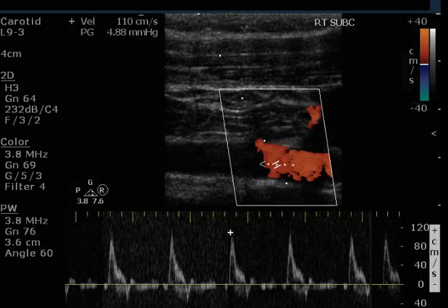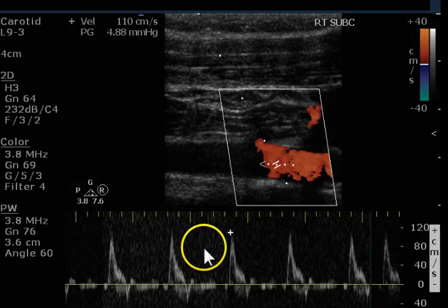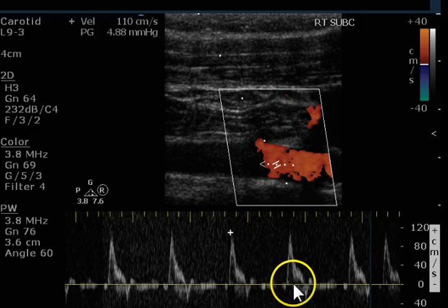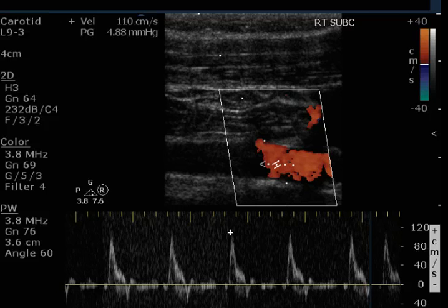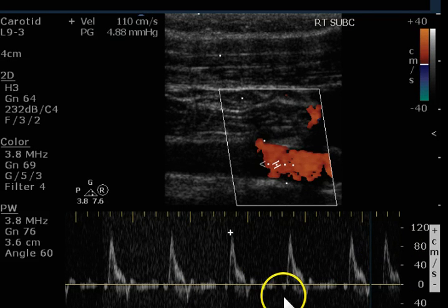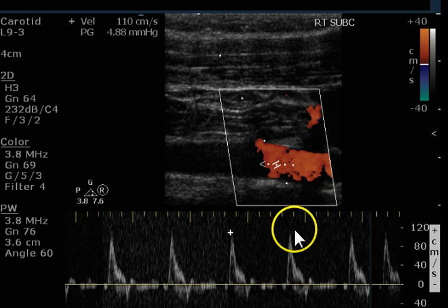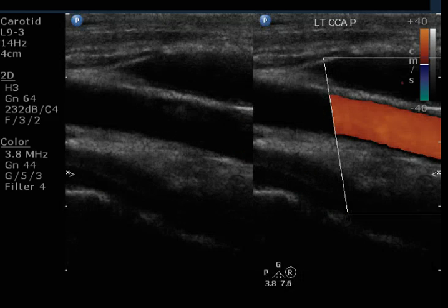Here's the right subclavian artery. We get a triphasic signal. Peak systole is perfectly normal and we've got reverse flow. Nice spectral window, very rapid upstroke — normal signal.